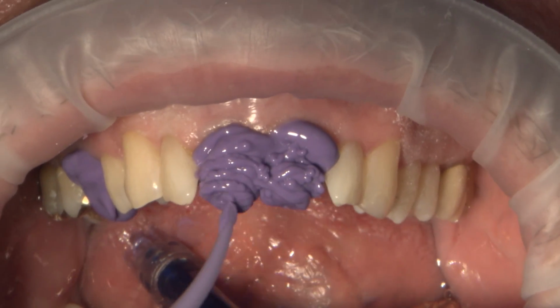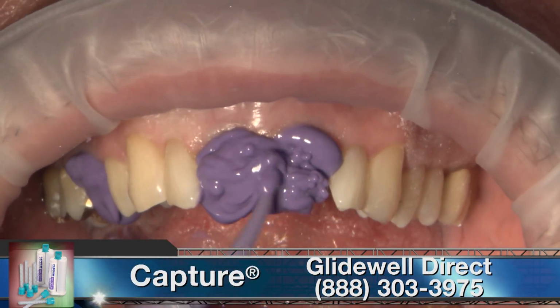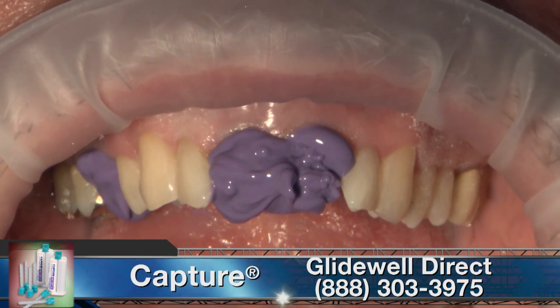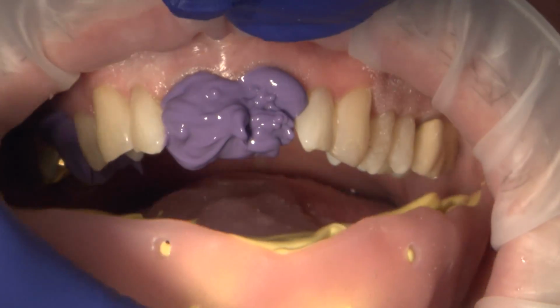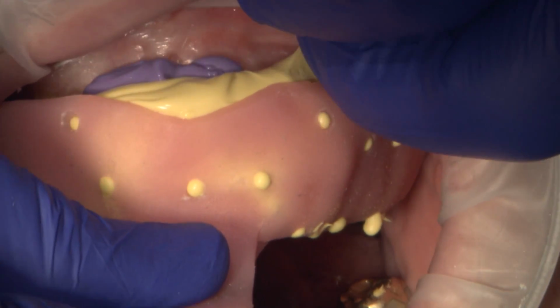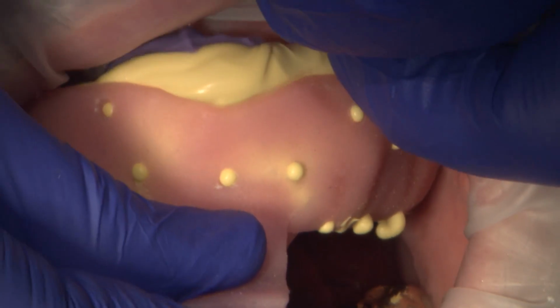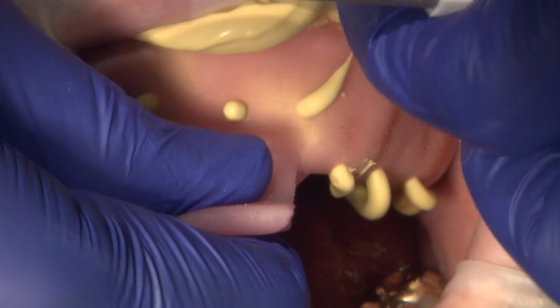Once the physical separation of the gingival tissues from the margins is verified, we then flow our light body Capture impression material into the sulcus around each prep, and then allow it to cover the entire preparations. Once the preps are covered, we will seat our custom tray that's been loaded with Capture heavy body PVS material.